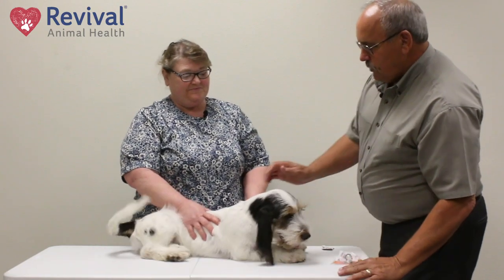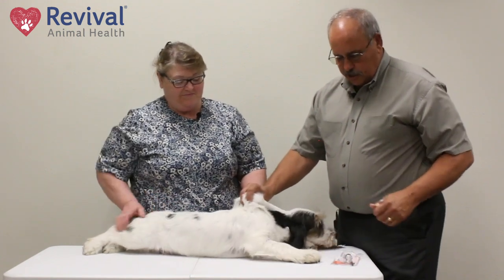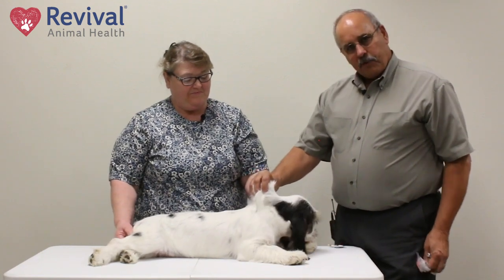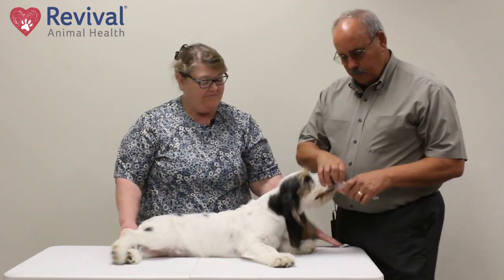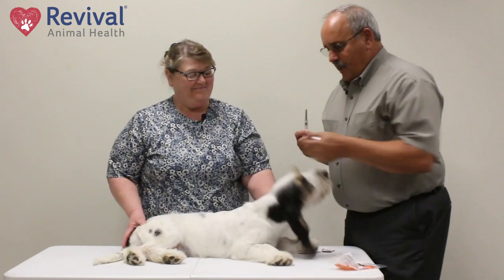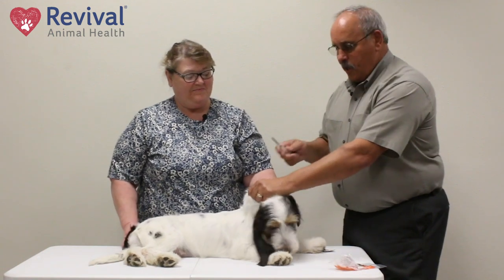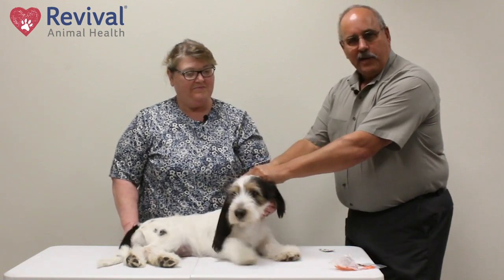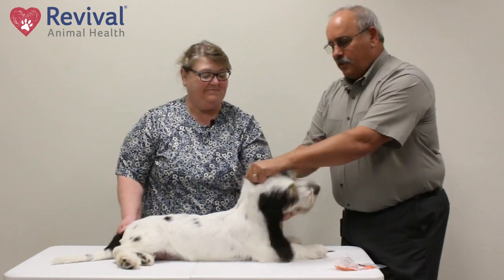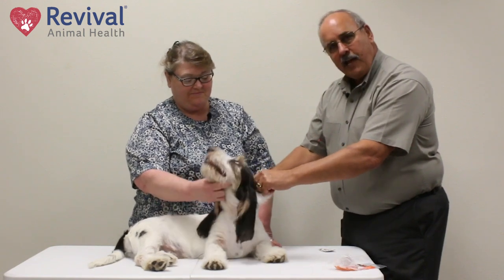There are a couple of sites we can do this on. One is sub-Q injection under the skin, and most people like to do it right here in the neck area. The one problem I warn you about is people will pinch the skin up. You need to let the animal know where you are — they'll put the needle in and all the way through and shoot it onto the ground or wall. So what you want to do is tent the skin and go with the tent — so under the skin with the tent.